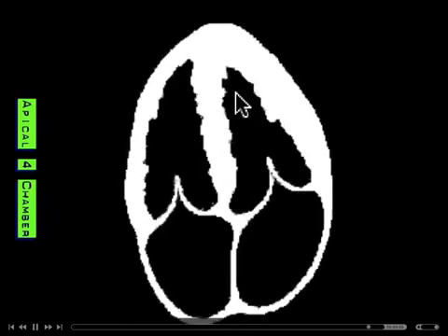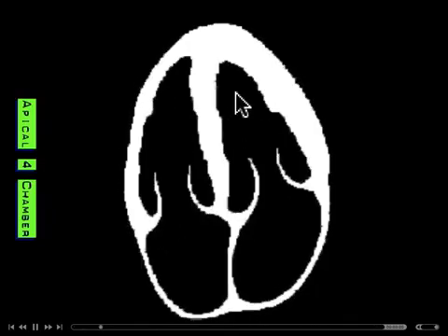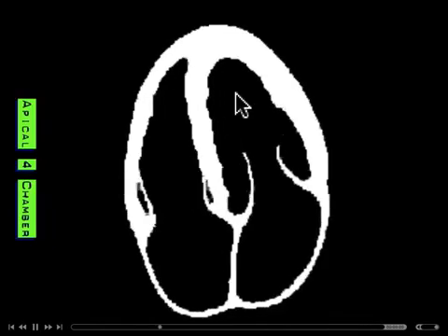Once it's coming out of this during systole, it's being pumped out of this LV, assuming there's not much mitral valve regurgitation. In other words, the blood is not going this way, but going right down into this little area that's out of the plane of view. It's a little bit more anterior, out of the plane of view, and that's where the aortic valve is.